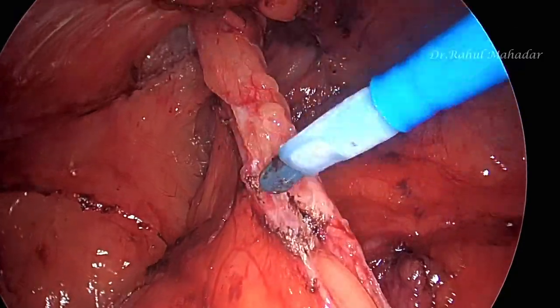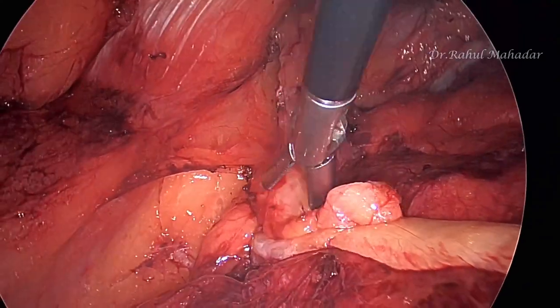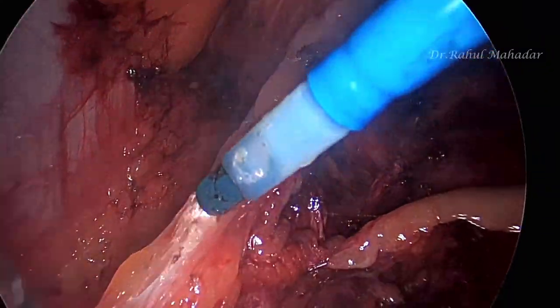The lipoma is being reduced and completely excised, disconnected from all its attachments.